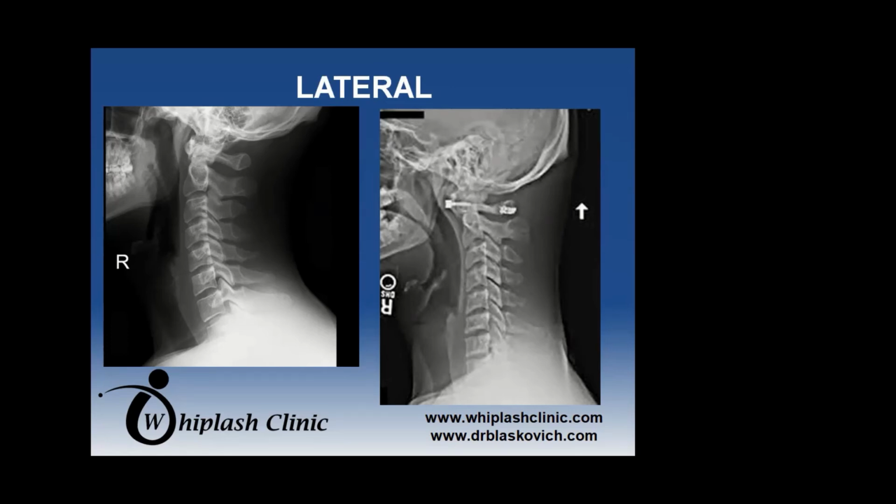And you can see how jewelry or metal objects can get in the way of the anatomy, and that's why it's pertinent to remove all that stuff if possible. Sometimes earrings are not able to be taken out, at least not very easily, and so we will by default let them keep them in unless it really gets in the way. But what other than the earrings, can anybody tell me looks not so normal on this right-sided image?